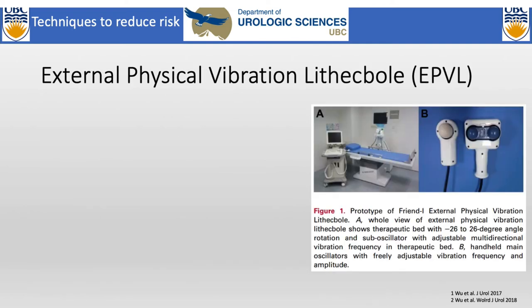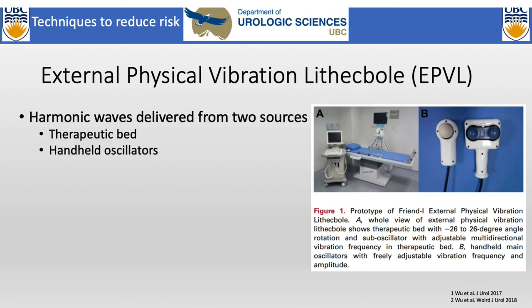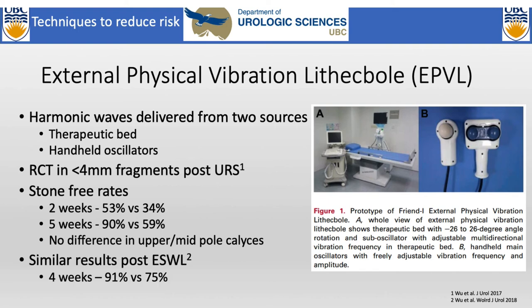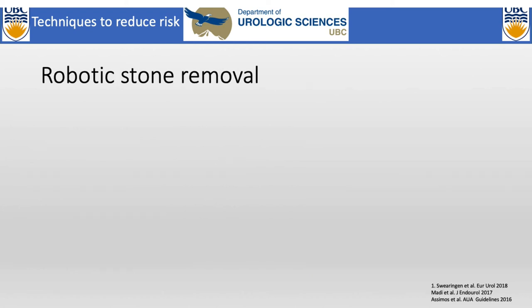This is one that I found somewhat entertaining. So you have a bed, the bed moves, you have these oscillators that send out harmonic waves, and you basically shake or bounce the stone out of the lower pole. It's the same as putting a person in Trendelenburg and pounding on their back, but done under ultrasound guidance. A couple of studies out of China looked at fragments smaller than 4 millimeters post-ureteroscopy. Stone-free rates were improved at 2 weeks and 5 weeks. And this is just a 20-minute procedure that's done not under anesthetic after they have their ureteroscopy or after they have shockwave lithotripsy done. So it's another option, hoping to prevent people from coming back to the emergency department with fragments, coming back for even further procedures, and reducing their radiation risk.